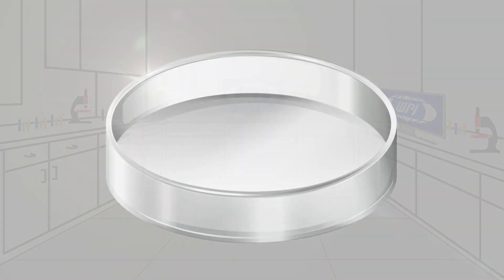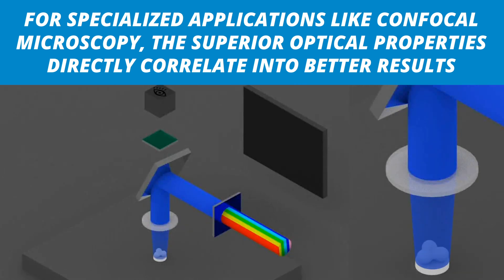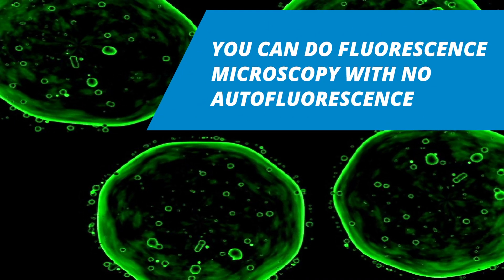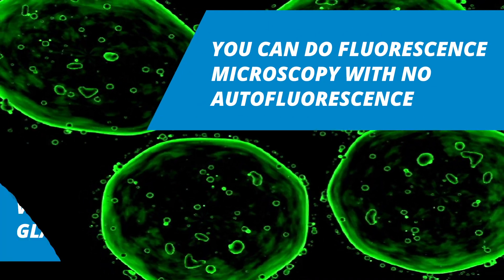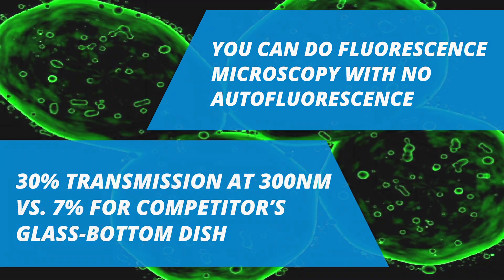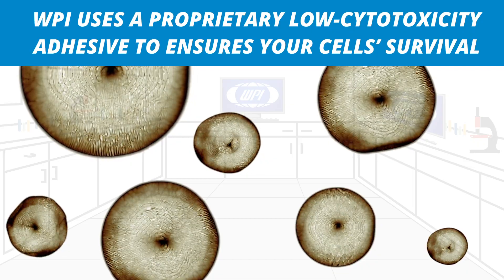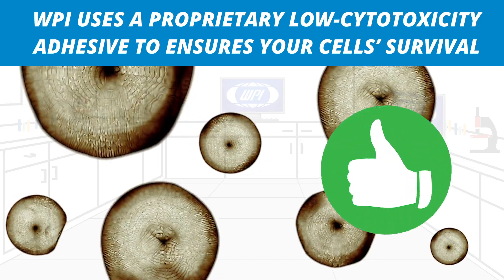The optical-grade glass bottom of WPI's FloraDishes means you observe less optical distortion. For specialized applications like confocal microscopy, the superior optical properties directly correlate with better results. You can do fluorescence microscopy with no autofluorescence, and it also means you get superior UV transmission. WPI uses a proprietary low cytotoxicity adhesive to ensure your cells' survival.